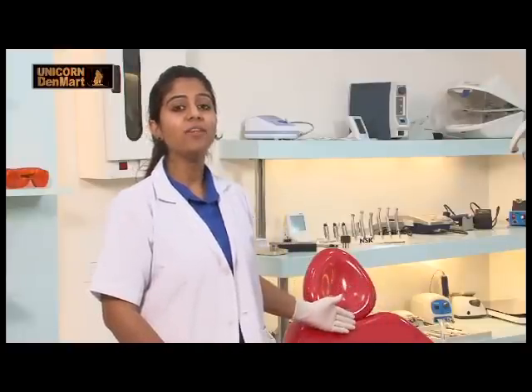Understanding the precision and accuracy an orthodontist needs, Unicorn presents Express Ortho — an ideal chair and a perfect companion for patients, providing a comfortable environment in the dental setup.